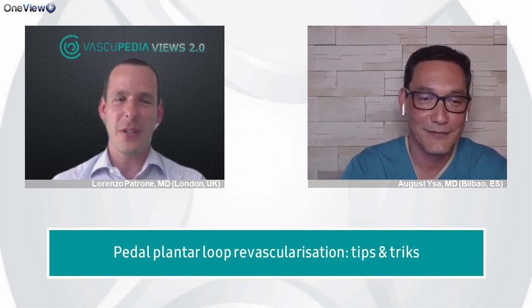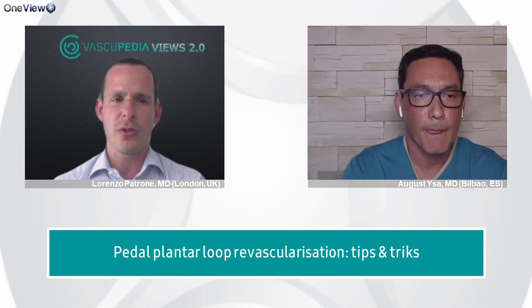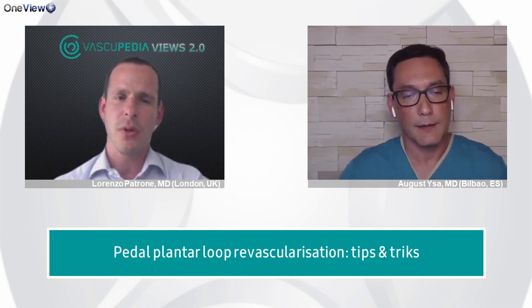Yeah. And when you do the foot arch, you said you're using 2 different 014 wires, the Regalia and then the Command. Does it happen that you use the same wire for both, or do you really like to change it during the recanalization? Because, for example, I use the Command 014 quite often to recanalize the foot arch.